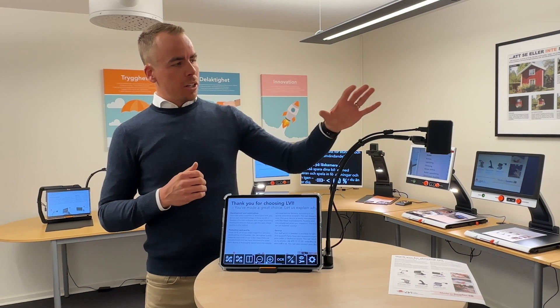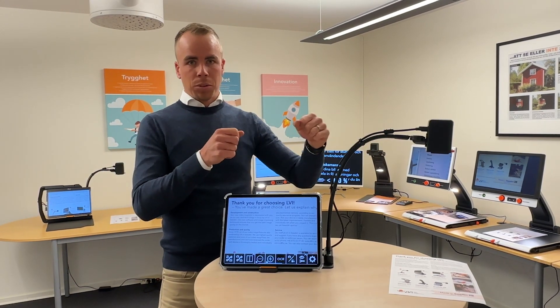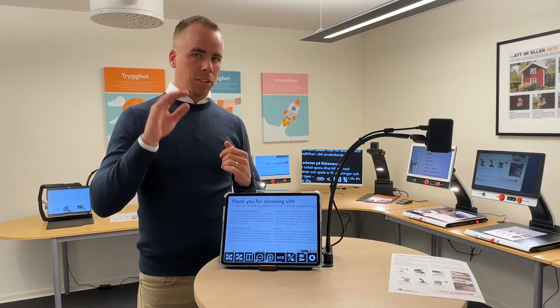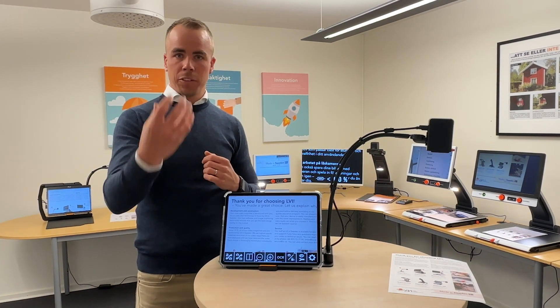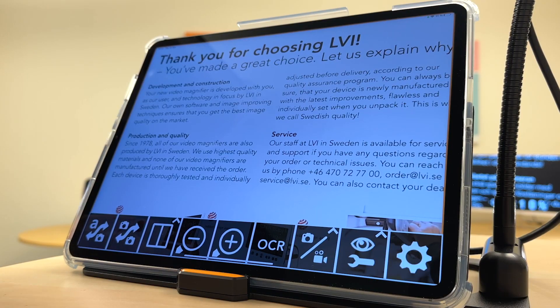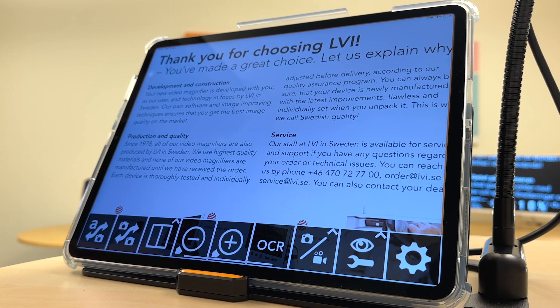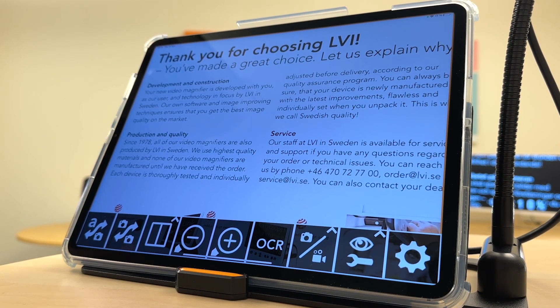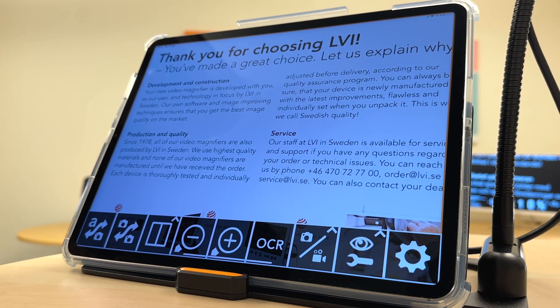The camera is based on a flex arm, so it's very flexible to adjust it to your needs, and the camera rotates in any angle — distance viewing, near reading, and self viewing. You connect the product to your iPad via Wi-Fi and you can be connected to the internet at the same time. You download the application from the App Store and then you are up and running.